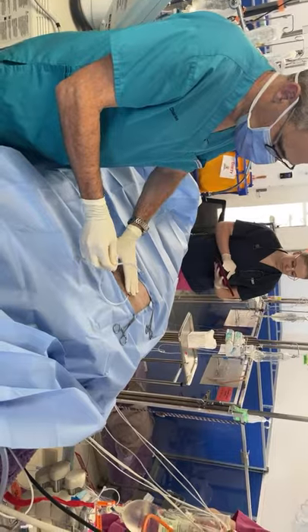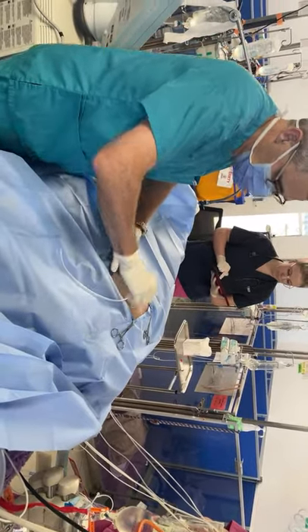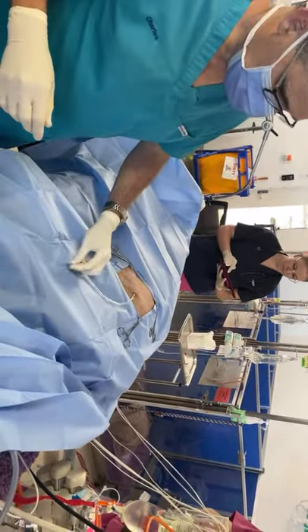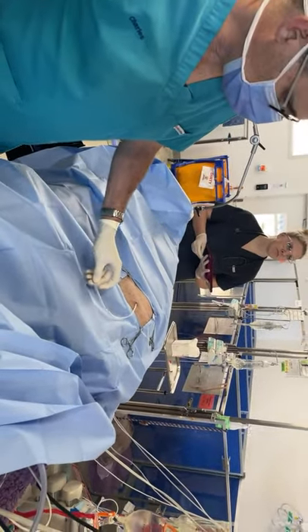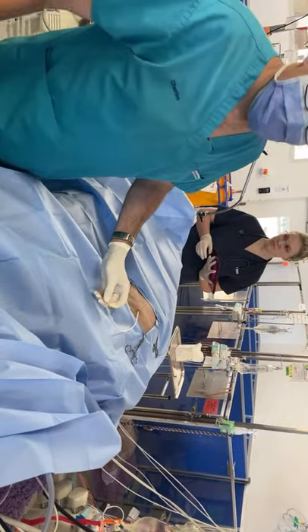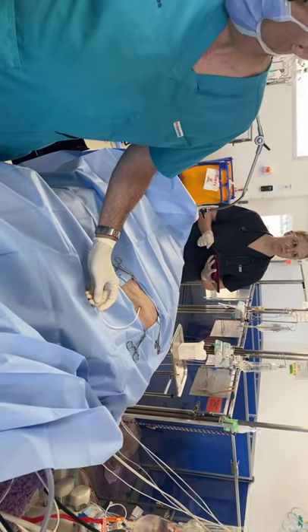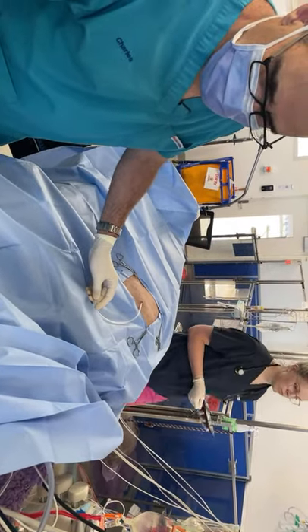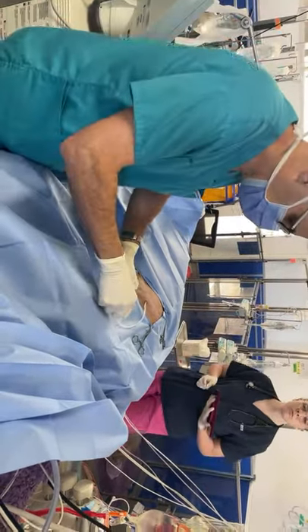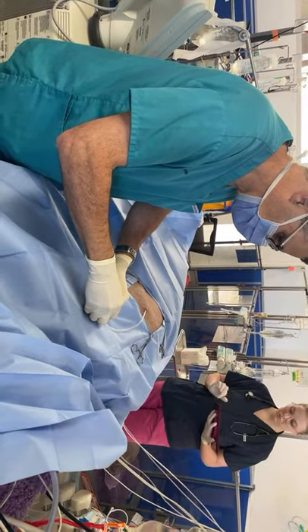Now that it's inside and open to the chest, I'll get a three-way stopcock and pinch this off so we don't create too much more of a pneumothorax. I'll connect it to the drain, get a 60 ml syringe, and start draining out the air from the chest cavity — hopefully we'll get a lot.